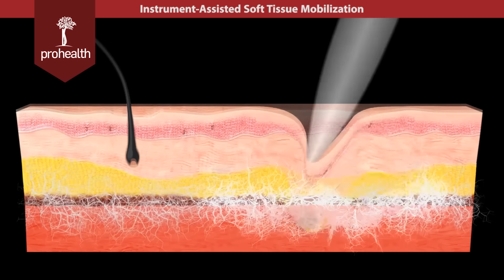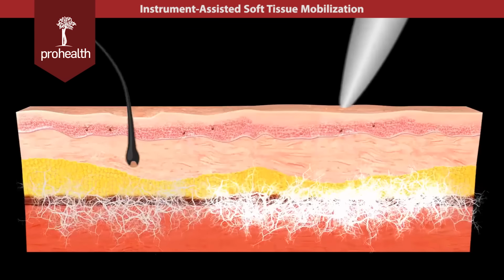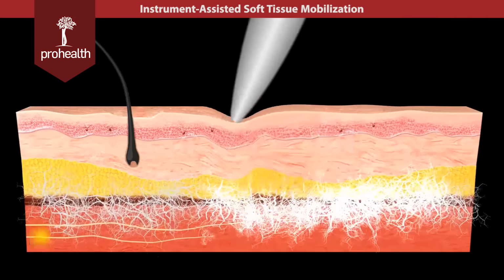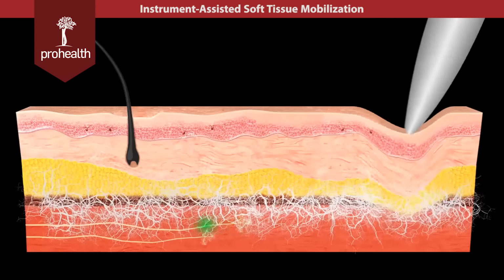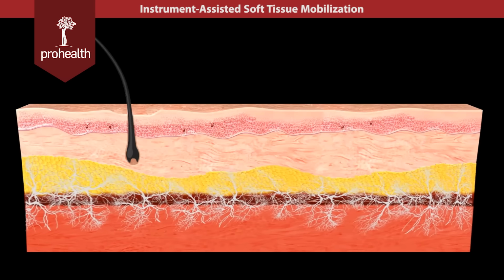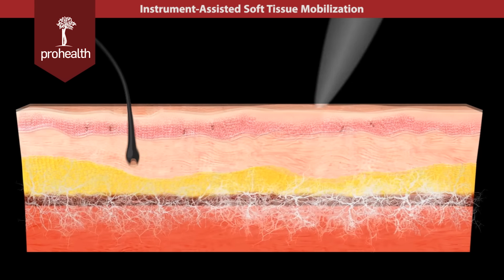Instrument-assisted soft tissue mobilization, or IASTM, can help loosen or release fascial adhesions through the use of special instruments and techniques. The beveled edges are able to specifically pull, stretch, and release fascial tissues. IASTM also promotes the movement of blood through capillary beds and stimulation of neurologic pathways and reflexes that affect muscle tone and mobility. Mechanical stimulation in conjunction with increased local blood flow and neurologic stimulation promotes optimal healing and function.